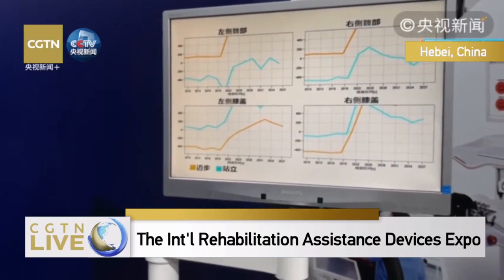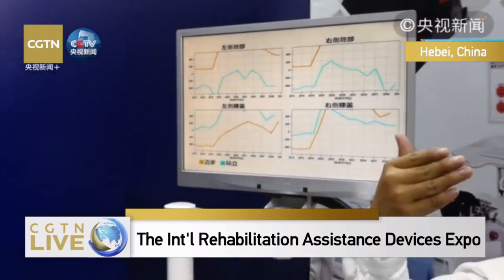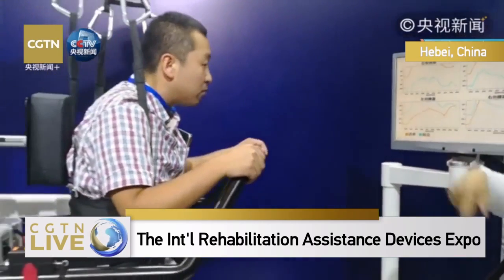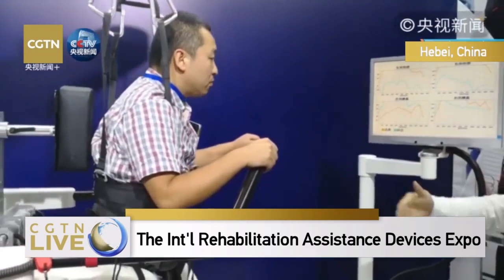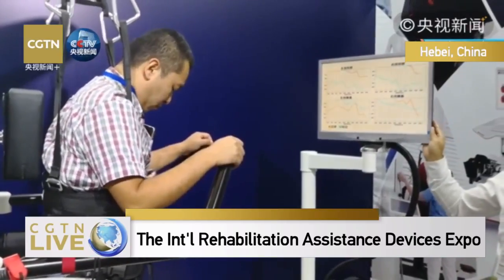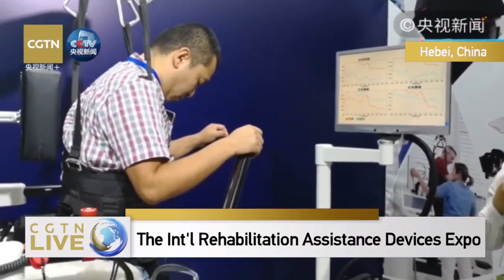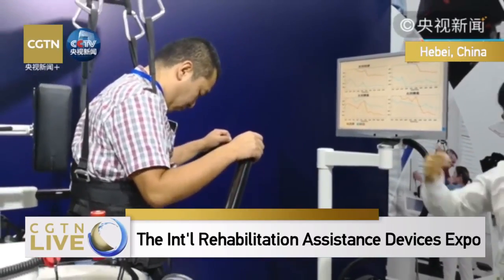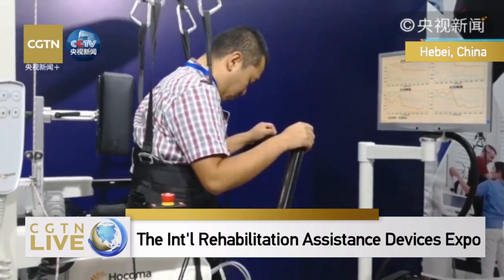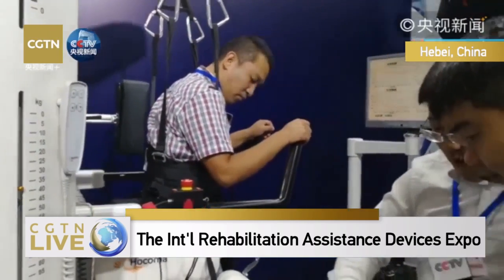So this very timely feedback can at the same time establish confidence in a patient. This is a neural and visual feedback so that the patient can obtain a sense of achievement. And also he would have a clear picture of whether his muscles have been actively participating in this process.